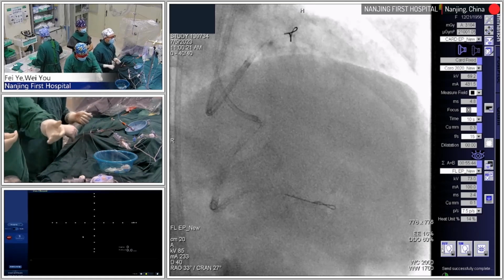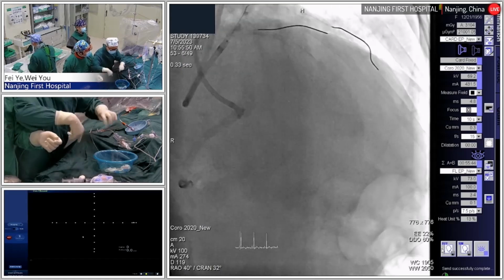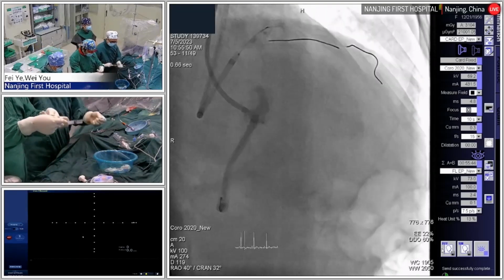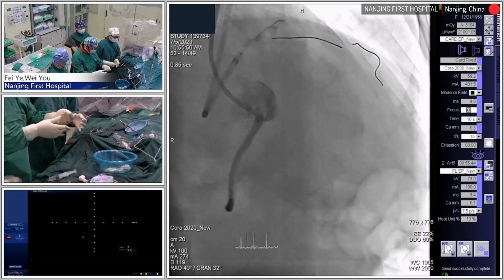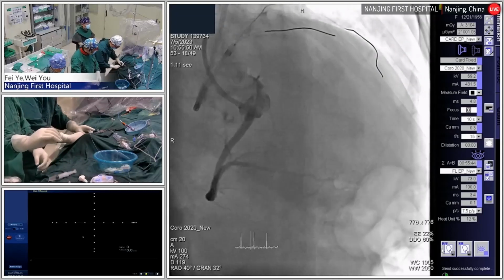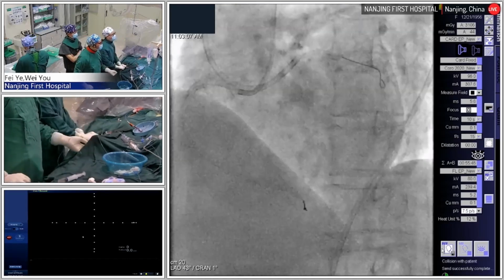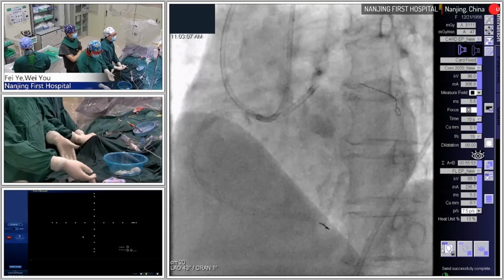Show me the previous angle. Yes, previous one. Yes, here. Did you flush this microcatheter? No. Give me. This is the same 1.7 French microcatheter from APT. This is a domestic microcatheter, suitable for the surfing technique. Low profile maybe better, although we can use the channel dilator microcatheter like the Corsair.